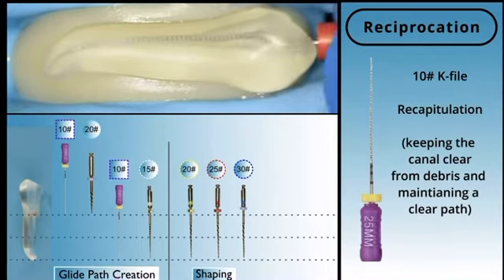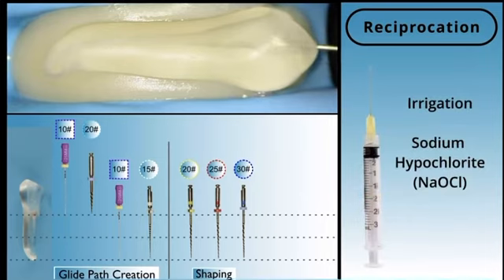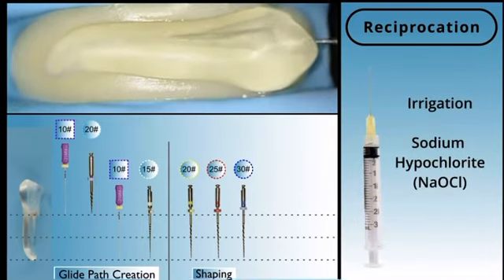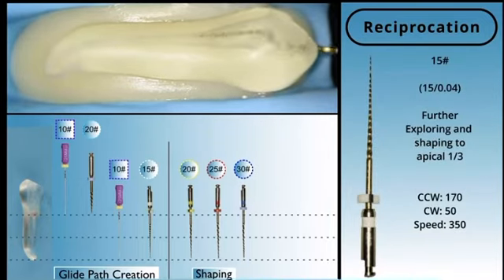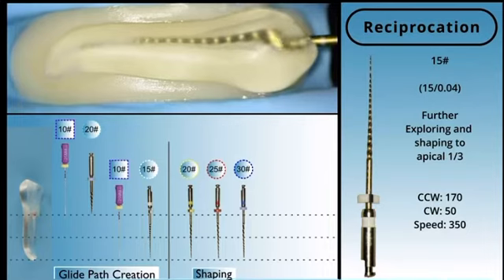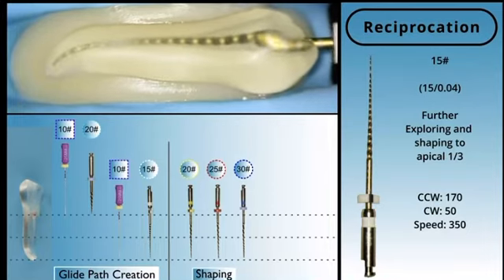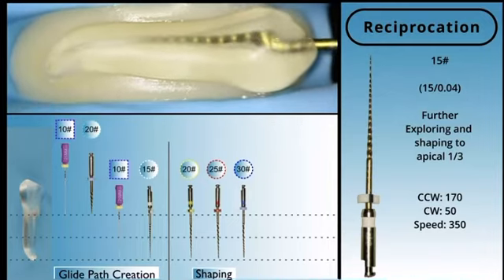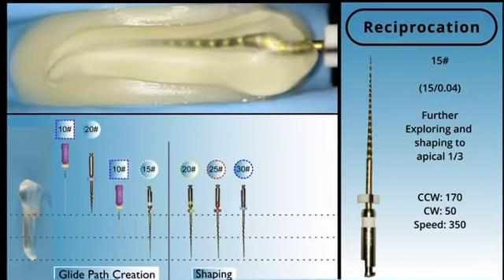Now it's really important to note that this tooth is not exactly the same as the last one. It looks the same, but the apical constriction is much wider. So just something to bear in mind when we're doing this demonstration. So again, using a size 15 glide file just to explore and shape up to the apical third or the apical constriction.